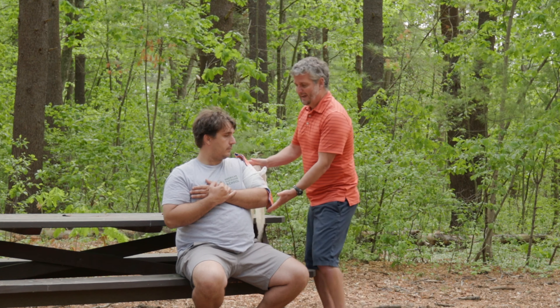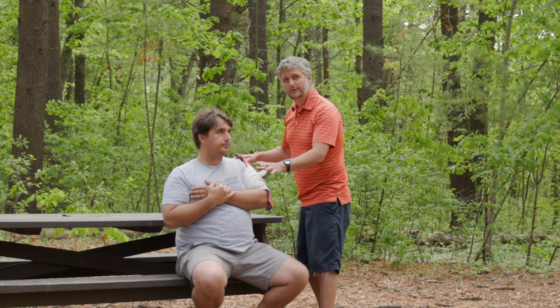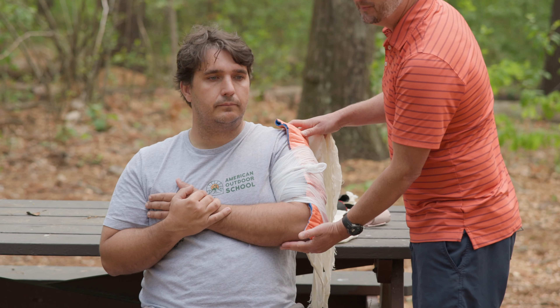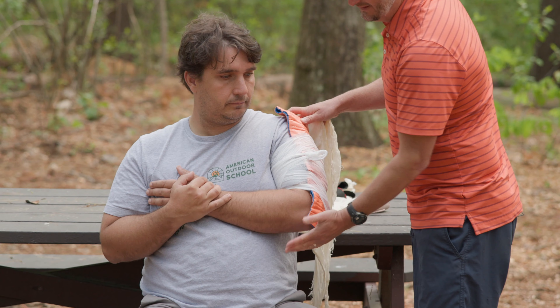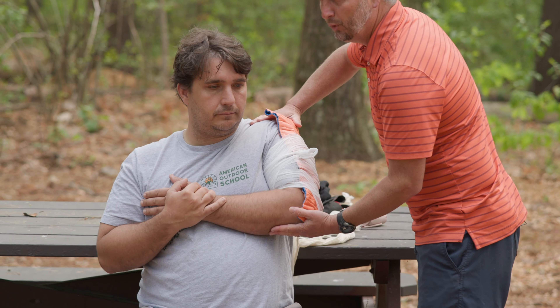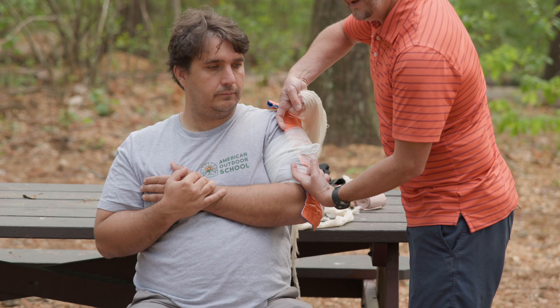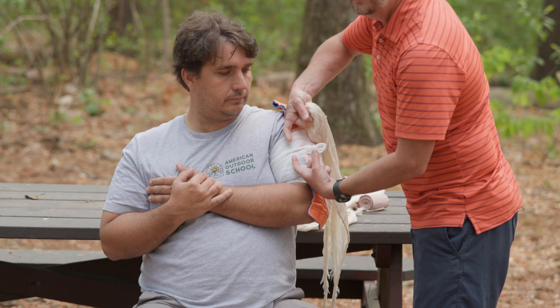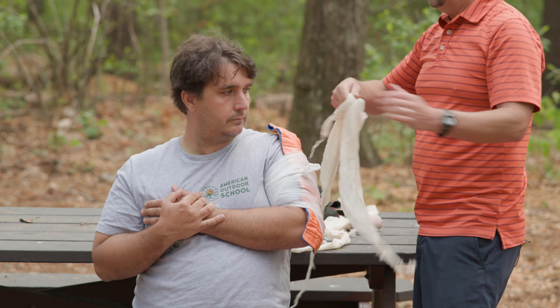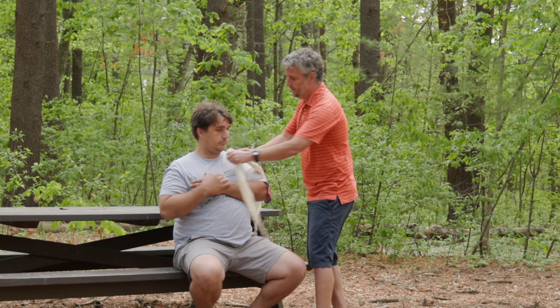Now that I have a splinting device holding this in place, I want to add my sling so this arm is not flopping around. This is where a big difference comes from a forearm fracture to an upper arm fracture. If I were to build my sling the same way, putting that knot right here, what can happen is the support is actually going to push on the humerus, pushing it up. And if these two bones are broken, it's going to cause a lot of pain. I'm going to support this arm in a different way.